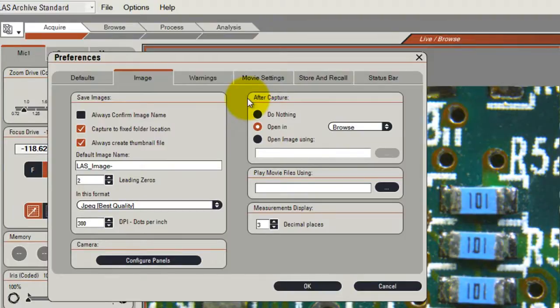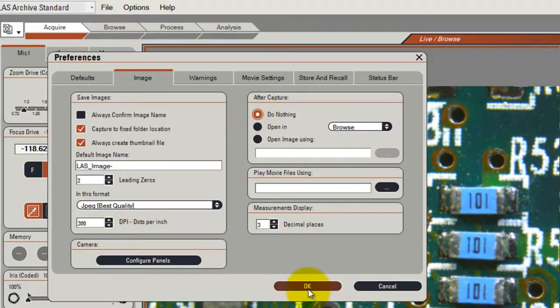What this is asking me is what I want to do with the image after I have captured it. After I have captured it I will do nothing — I will simply stay in the acquire workflow. And now I click OK.